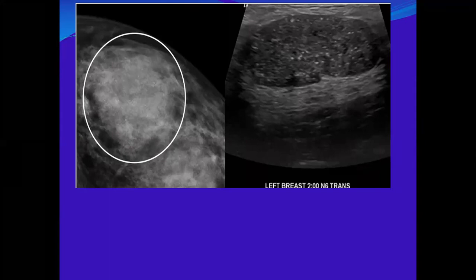Is it indistinct on ultrasound, this mass? Okay, if you said this area is indistinct, I cannot guarantee 100% that it is indistinct, because it is not at the center of the probe. I need to angulate and see these areas with different angulations.